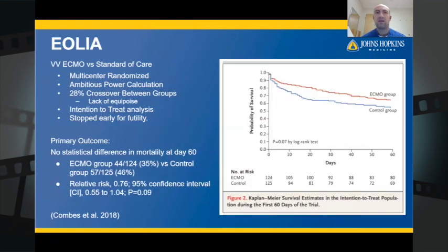So I'd like to cover a little bit about extracorporeal membrane oxygenation for severe acute respiratory distress syndrome, the EOLIA study by Combes in 2018, published in the New England Journal. The trial was a follow-up to address many concerns over the validity of the CESAR trial.